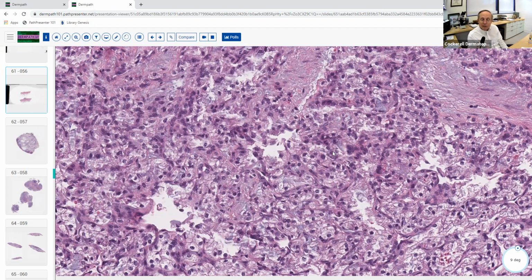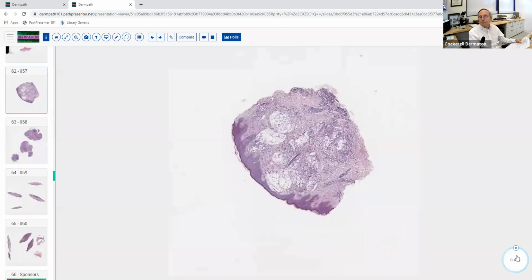So they might ask you this, they might ask you metastatic breast cancer, possibly metastatic colon cancer, but they're not going to ask you anything weird or too terribly many things about that. Now, they might ask you something about other diseases associated with kidney cancer, like the Birt-Hogg-Dubé. They might show you this patient might have which skin disease, for example, which skin syndrome might be associated with this. So they could possibly ask you a second order question on that. So it's a pretty good example of metastatic renal cell carcinoma, and hopefully you guys were able to recognize that.